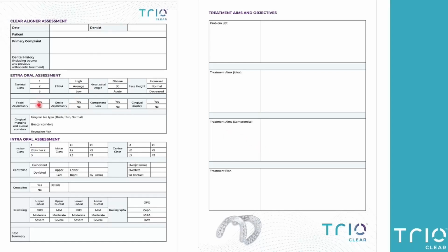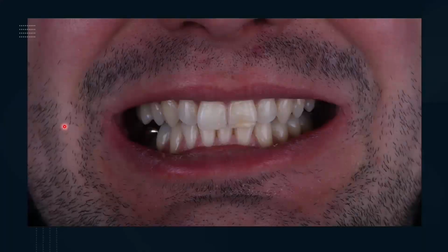Facial asymmetry here. Everybody has asymmetries in their face, and this one is no different. You just have to spot it. Always tick yes to that, and then try and see where the asymmetry is. So here, asymmetry here, and then we've got these asymmetrical laterals. This guy's not far away from symmetrical. We'll talk to you about the midlines in one second.